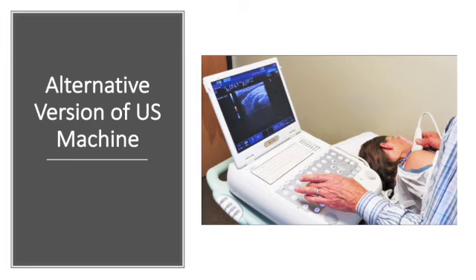This is a lot easier to use in multiple settings. This is the type of machine that when I was first introduced to ultrasound, this was the hot one on the market. So there's a lot of good to this one. This unit runs a little more expensive than your average unit now.